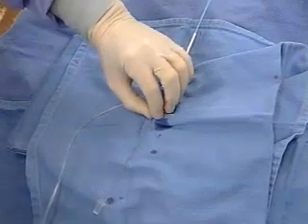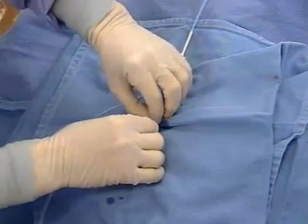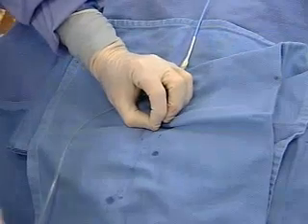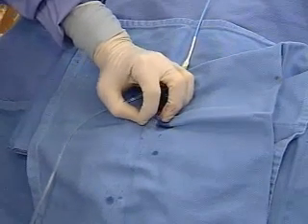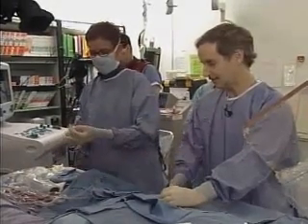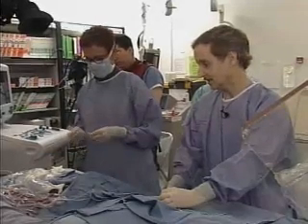So now you can see that wire is way down in one of the branches, way past the area of blockage. So our first few pictures we use as a road map, and we can easily compare the bend of the wire, the bends that it takes as it goes down the vessel, to the road map, and manipulate that wire. The advent of the wires, I think, was the second major advance, after the balloons initially came out. The advent of the wires really made quite a difference.